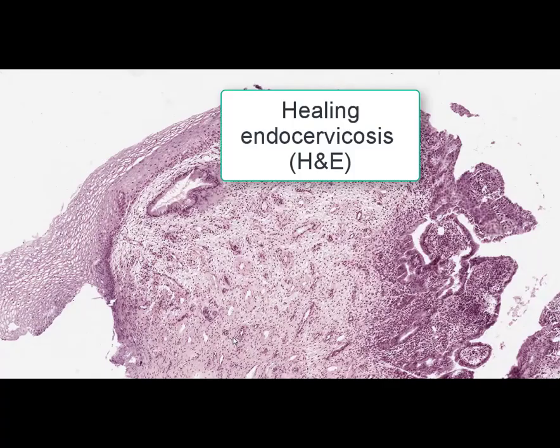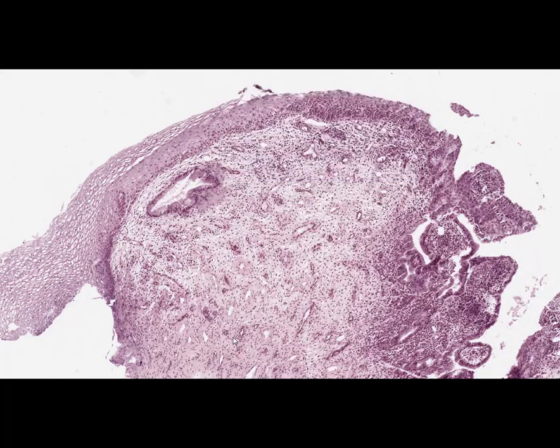On this slide we can see a uterine cervix, stained by hematoxylin and eosin. The name of the slide is healing endocervicosis. Endocervicosis, or cervical pseudo-erosion, also known as glandular erosion, is a pathological condition based on metaplasia — specifically replacement of non-keratinized stratified squamous epithelium by single-layered glandular epithelium. Three consecutive stages are distinguished in the course of endocervicosis.